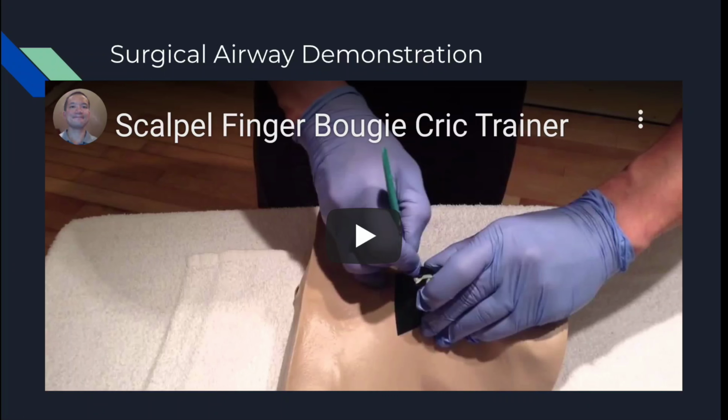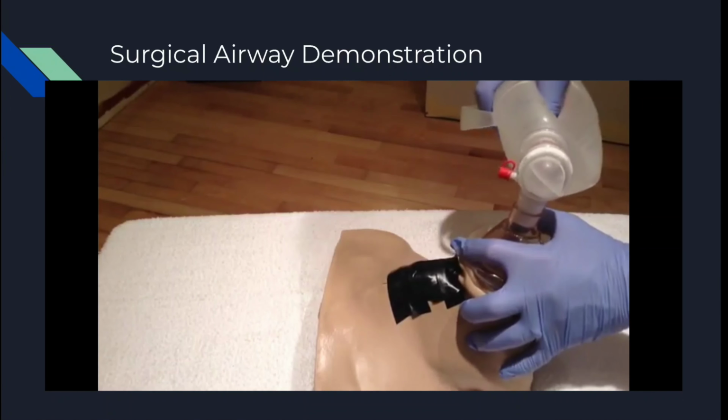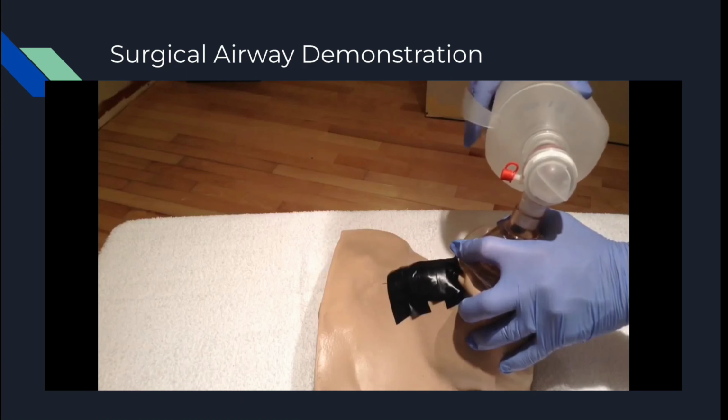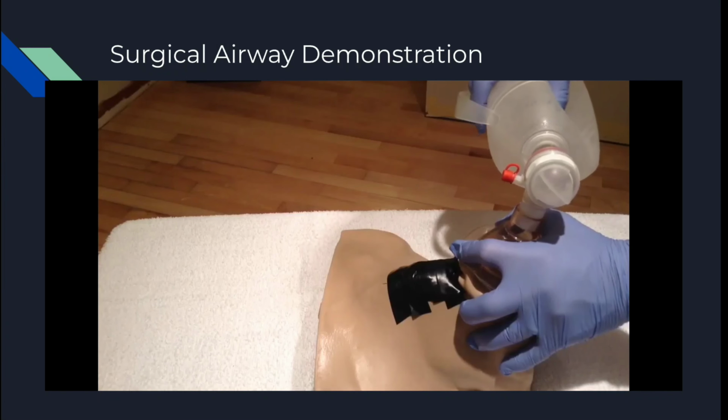Simulated skill anyway. Okay, listen up, everybody. We're running into trouble. The stats are continuing to drop. We're in a can't intubate, can't ventilate or oxygenate situation. Let's call for help. Call ENT and anesthesia. Get another emerg doc in here, please. Okay, break out the cric tray there, or the cric kit there, please.